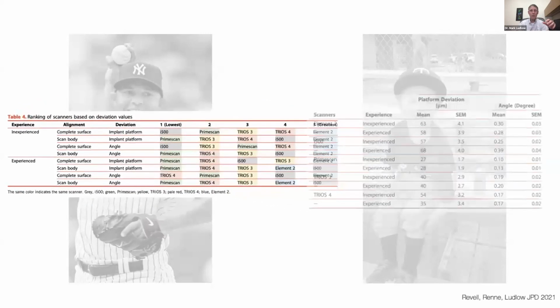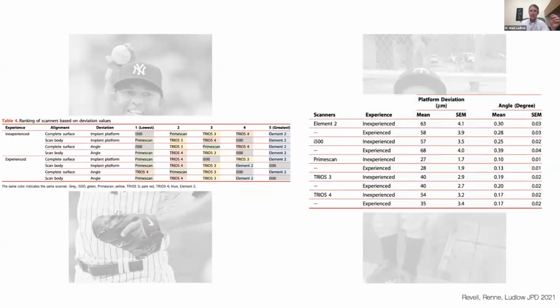And what we see as well when we look at the data is there are some scanners that, even if you're inexperienced, can still get you basically the highest level of fidelity as someone that has scanned for a long time, okay? And so that's one of these things when you look at a scanner: go ahead and get your rep in there, bring a couple scanners, you scan your assistant, have your assistant scan you, and really feel the difference between these things, because there are slightly different nuances in how you scan.